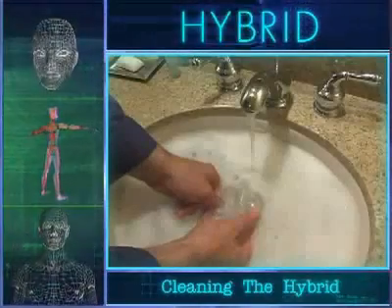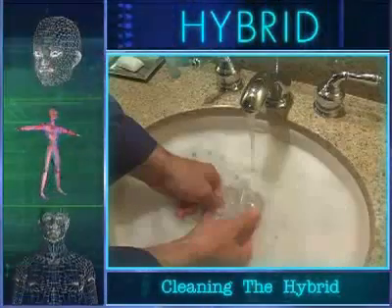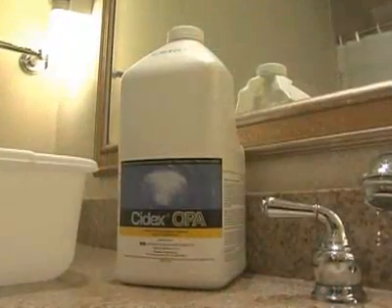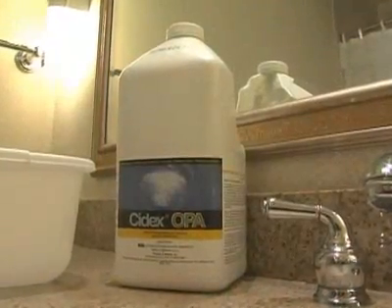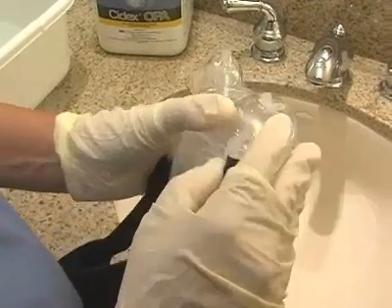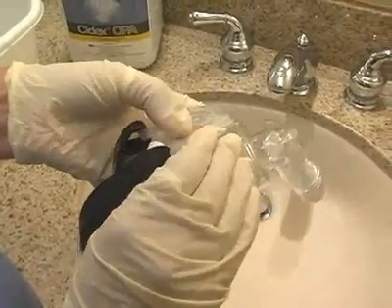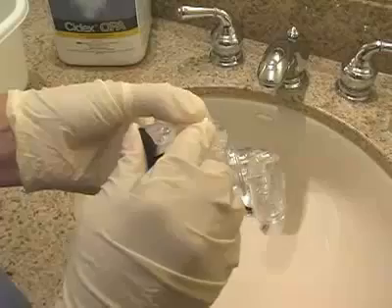To clean and disinfect the hybrid universal interface in a clinical setting, we recommend using a prepared solution of Cidex OPA. Unsnap the headgear from the hybrid. The headgear, with its buckles attached, should be cleaned separately with warm water and soap.